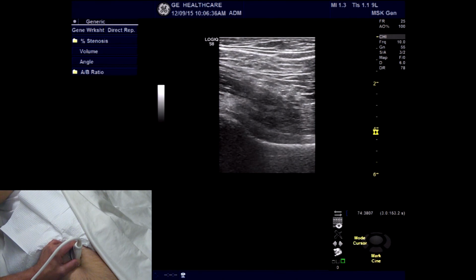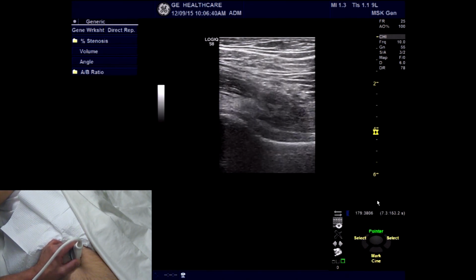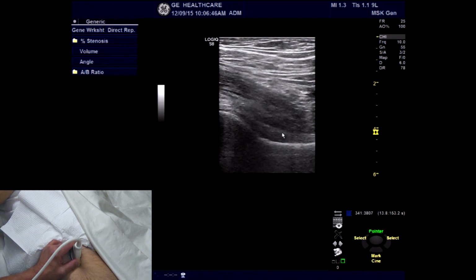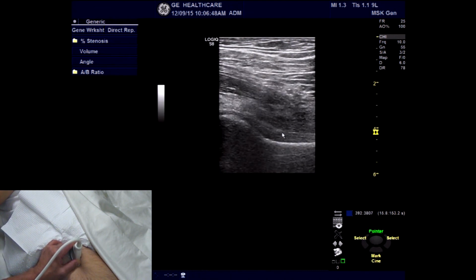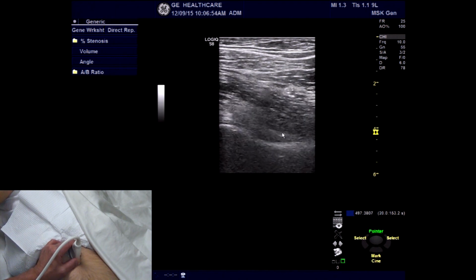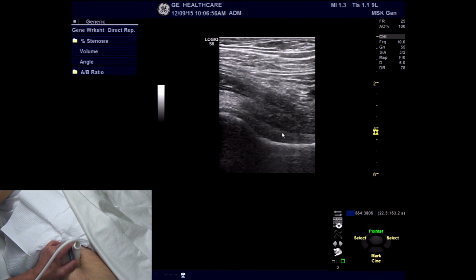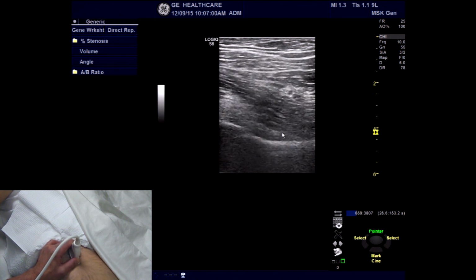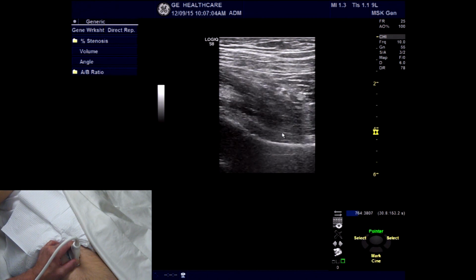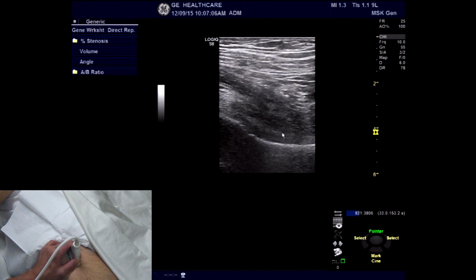Now, I want to show you what happens when we internally and externally rotate the foot. And this is the leading edge of the capsule, anterior capsule hip. So if we internally rotate the foot in, we can actually make the capsule artificially thickened. And then if we roll it back out, that would be the normal appearance of the capsule. Again, internally rotate can actually thicken the capsule and externally rotate. So you want the foot in slight external rotation.